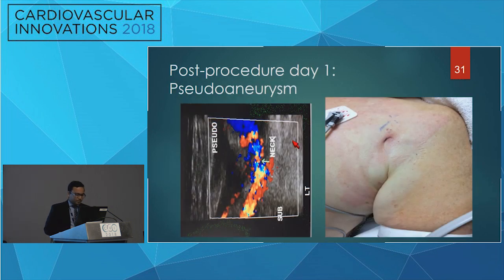So post-procedure, we got this image, showed a pseudoaneurysm with a narrow neck right there. Sorry, I should have entered the image.